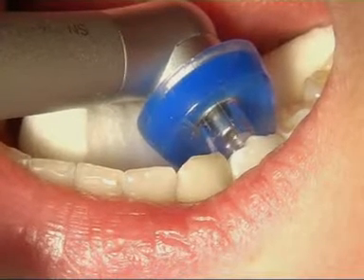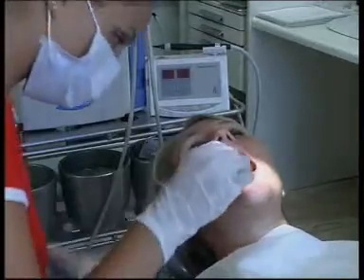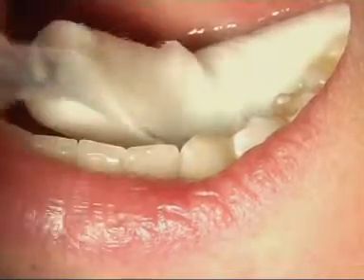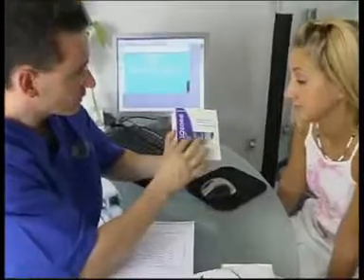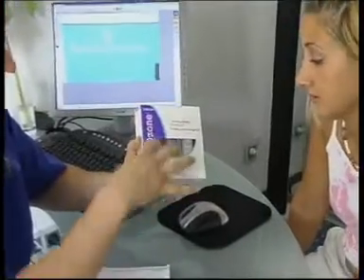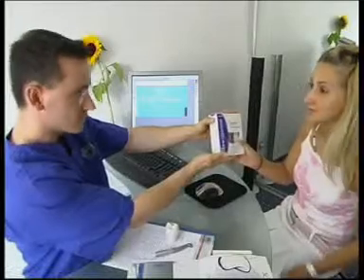The cup again remains on the tooth for the rinse procedure. Apply the pH balancer in preparation for mineralization. The remineralization process occurs through the patient's use of the Helosone patient kit at home. Remember to inform your patient in detail about the role they play in their own caries treatment.